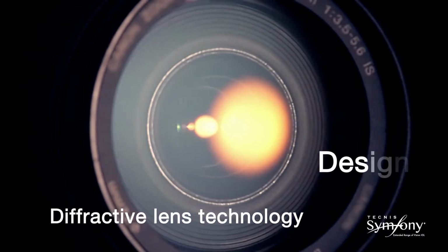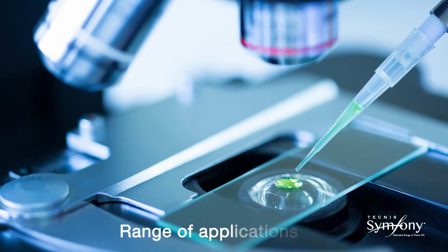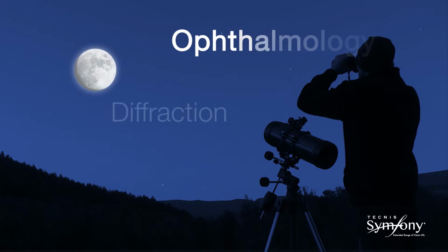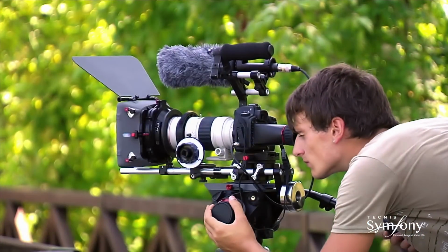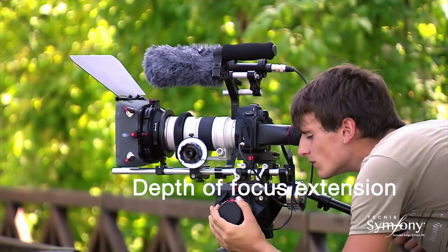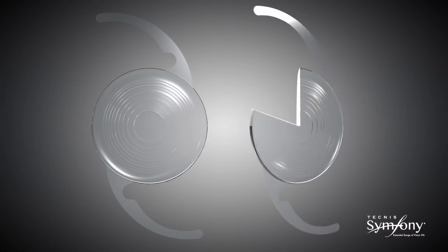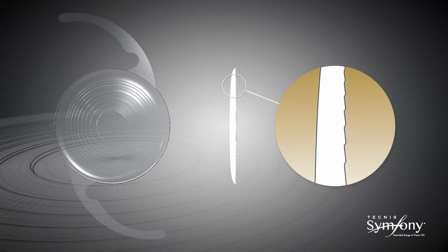Diffractive lens technology and design is well understood in the field of optics, having a wide range of applications, from astronomy to nanotechnology. In ophthalmology, diffractive technology is generally associated with multifocal lenses. However, in the optics world, it is widely known that diffractive technology can be employed to achieve a variety of outcomes, including depth of focus extension. As a matter of fact, light can be distributed in almost any desired way by modifying the echelette design of the diffractive lens. The echelette is the relief or profile of the lens, meaning its height and shape within each ring. The design of the echelette determines how the light is transmitted through the lens.